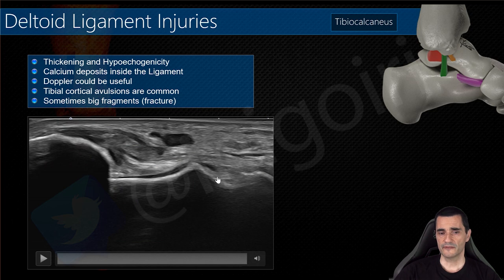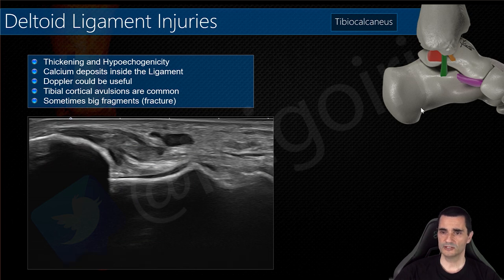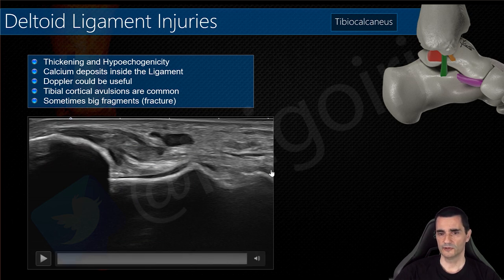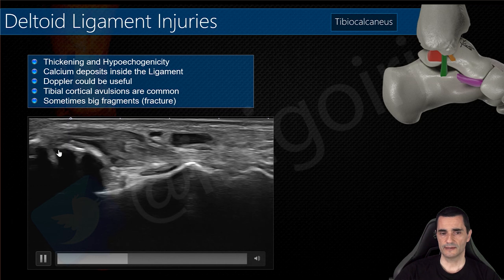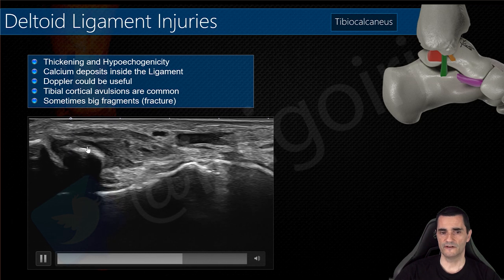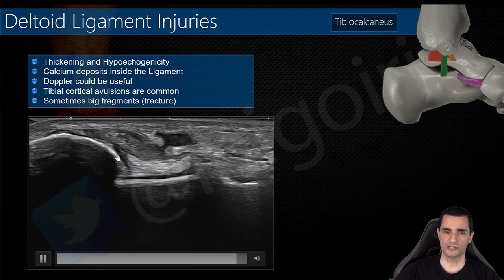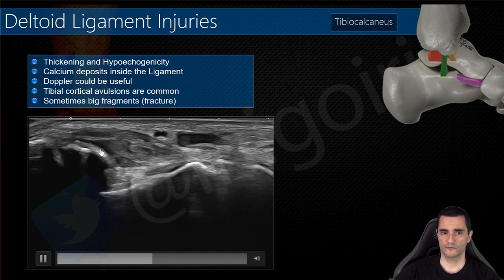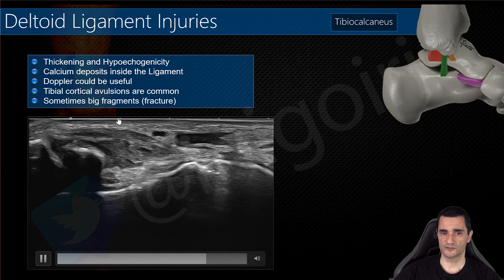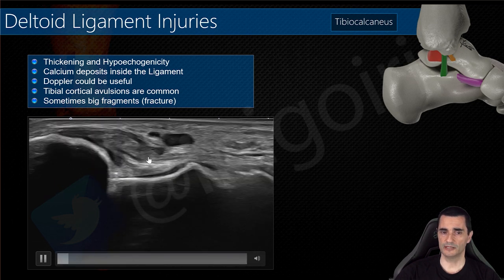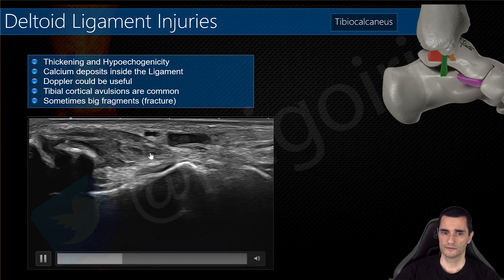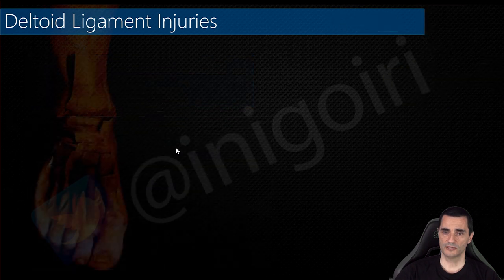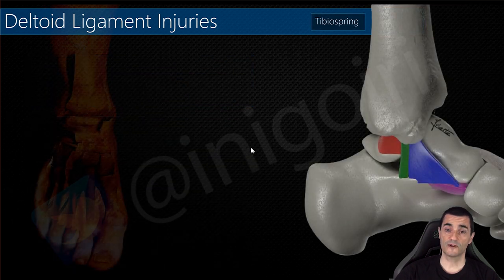This is another example — not the tibiocalcaneal but the tibionavicular ligament — included to remind that sometimes the avulsion will be very large and we are talking about a small fracture. This is a bone fragment of one centimeter at the medial malleolus. Be careful because sometimes we will be talking about a fracture.